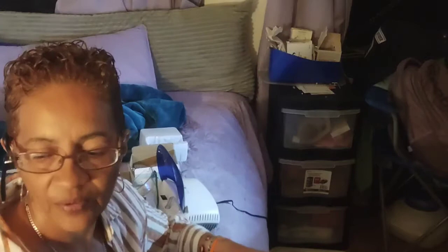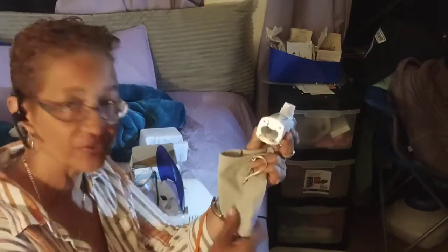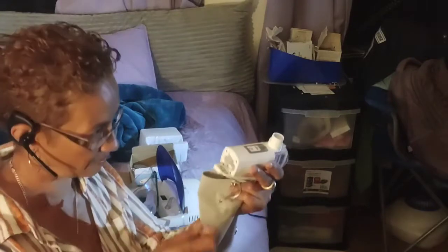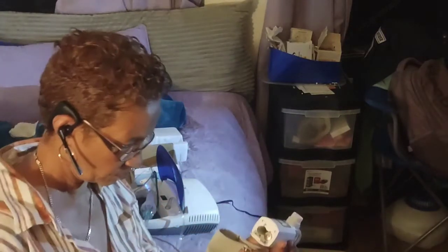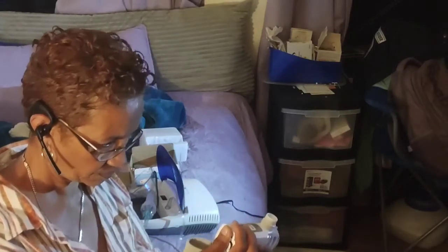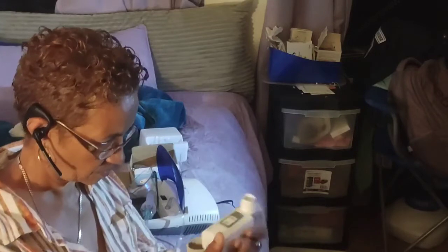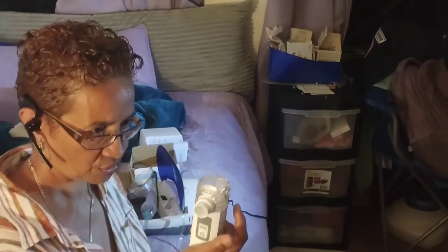So, guys, there we go. So I'm going to put the 2 batteries back. And I'm going to get more batteries to keep in here, okay? Because it's best to have several batteries in here, so you'll be on the safe side. Positive and negative. Okay, guys. So there it is. It's not doing anything because it has no liquid in there, okay, guys? So we don't want to burn it. So we shut it off.